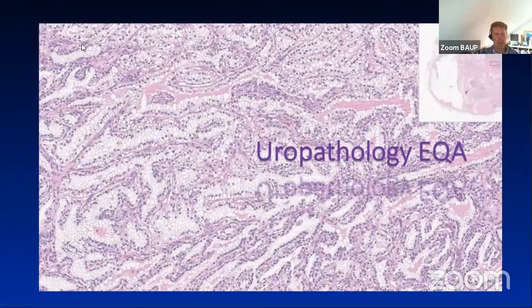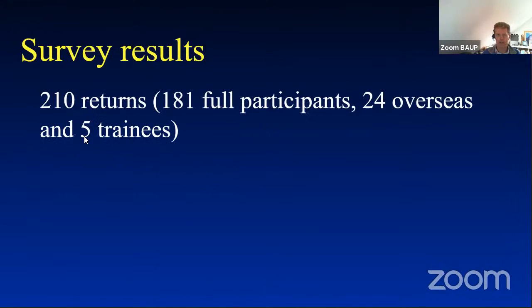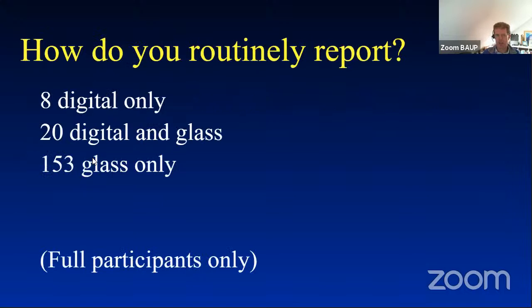Okay, so the next part of this session is not going to take very long. It's just the feedback from the survey that we did talking about going digital in the EQA. So we had 210 returns, of which 181 were the full participants. And the questions were, how do you routinely report? And not surprisingly, 8 were digital, 20 digital and glass, 153 glass only. So the digital revolution has certainly not hit the UK.